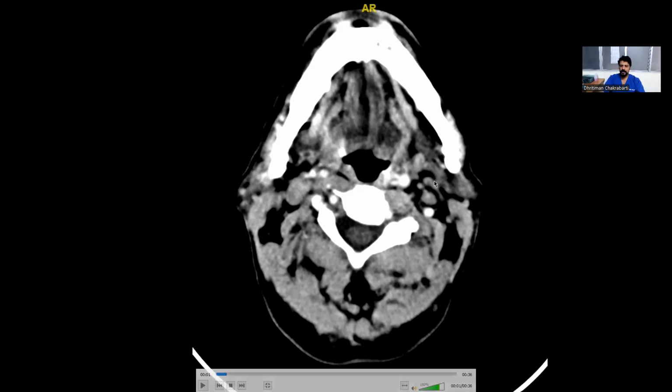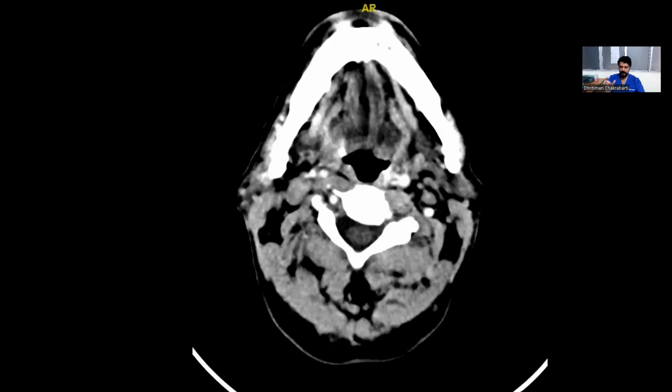Initially when you start, there are a few things that you need to know about the CT scan. When these CT scans are taken, they ideally should be taken with the patient's head straight. And although they take the CT scan of the entire skull, they take it in slices, right? And the slices need to have a specific angle so that you are able to make sense of what is going on. So the convention is to take the slices parallel to the skull base. Like this basically. They are supposed to be taken like this.